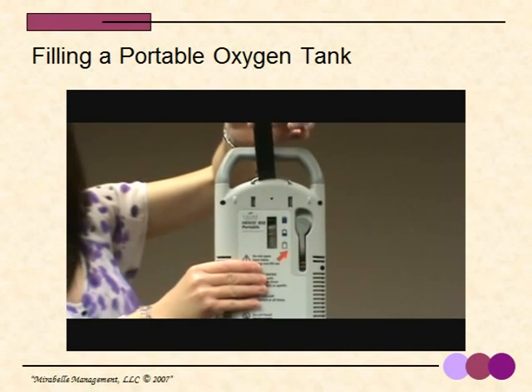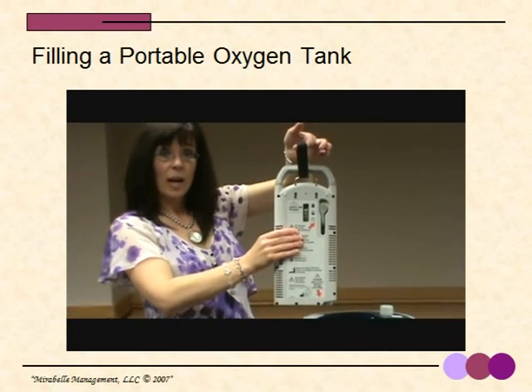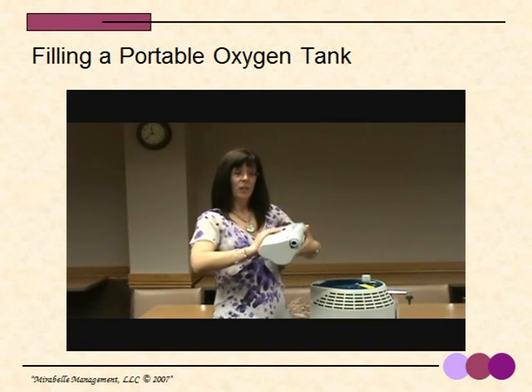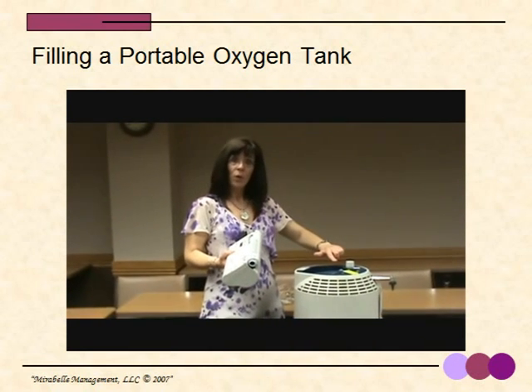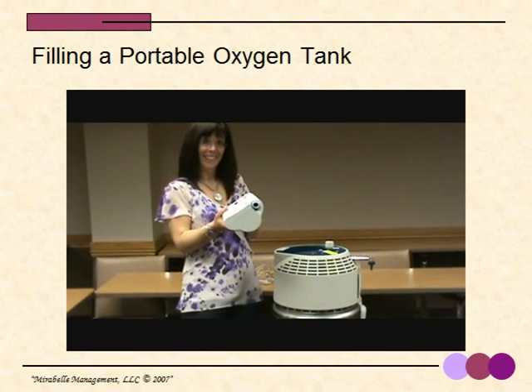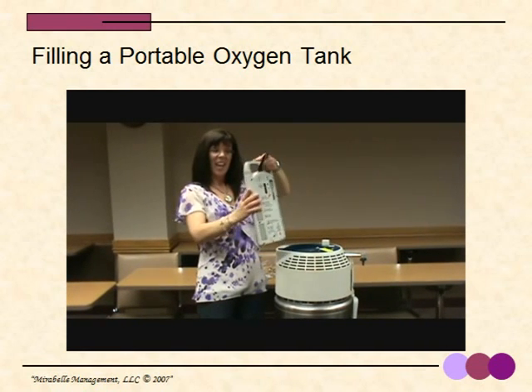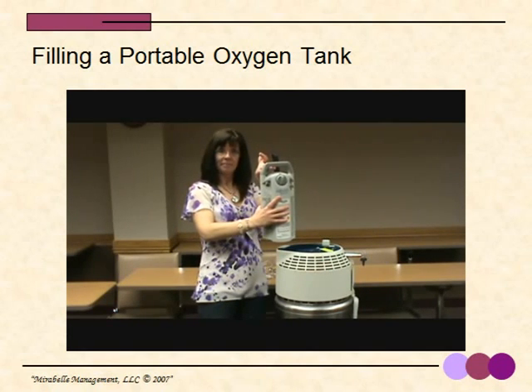Now, many tanks are different, but the principles are the same. Usually there is a strap that you would hang on to that would show the volume of the tank. And be very careful to not touch the bottom of this tank or the top port of this liquid system, as it's much like sticking your tongue on a frozen pole in the playground, and that hurts. So that is how you fill a portable tank. And you should get about 4 hours on 2 liters with this system.